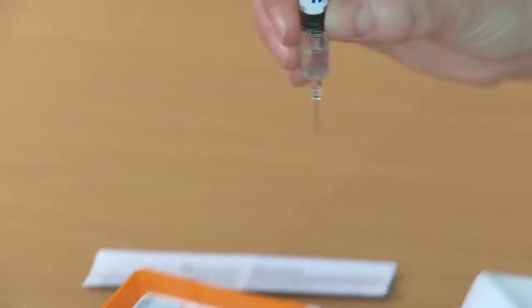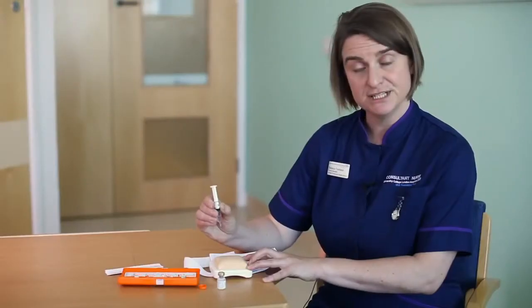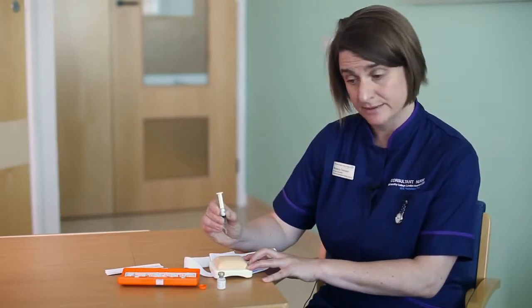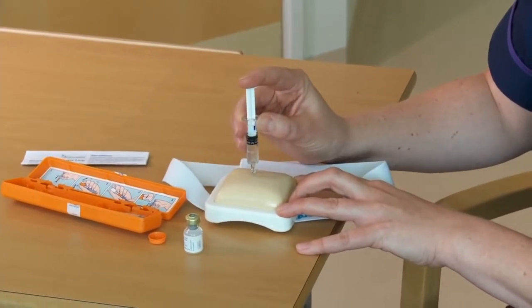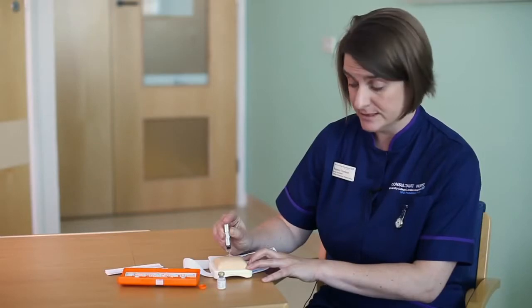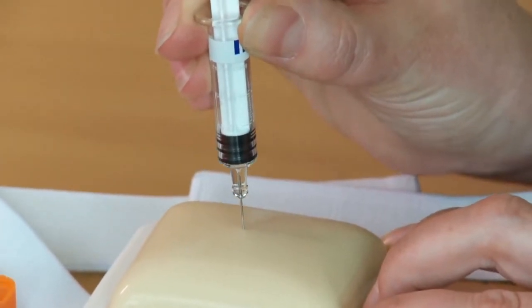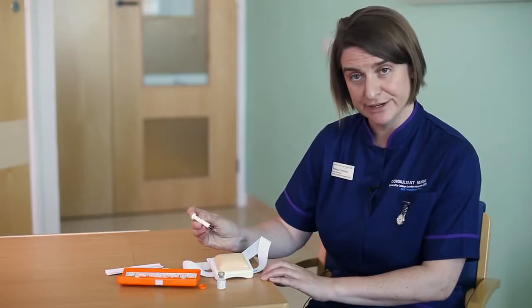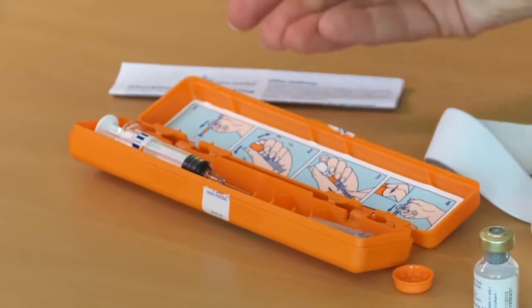So taking the glucagon injection, you've already decided whereabouts on the leg you're going to give it. Now the injection needs to be given at a 90-degree angle, so straight down. So it goes all the way in, and then you're going to deliver the full dose because we're imagining that this is an older child. Once that full dose has been given, take the needle out. And obviously this is an emergency situation, so it's unlikely you're going to have a sharps box, so place it somewhere safe, for instance in the orange container.